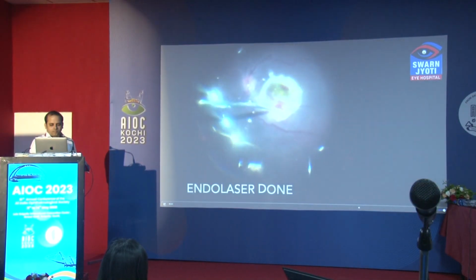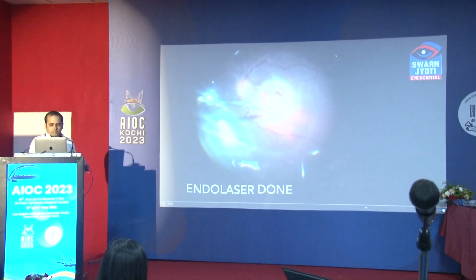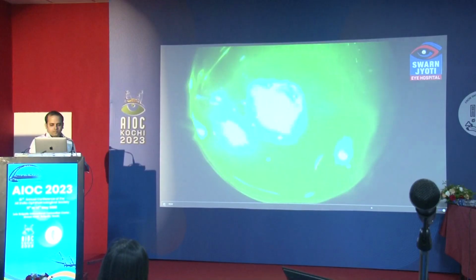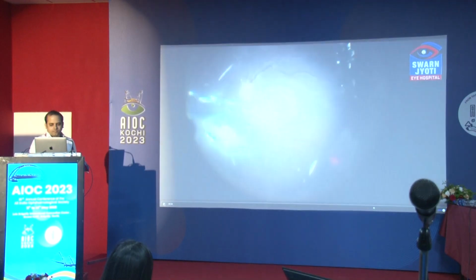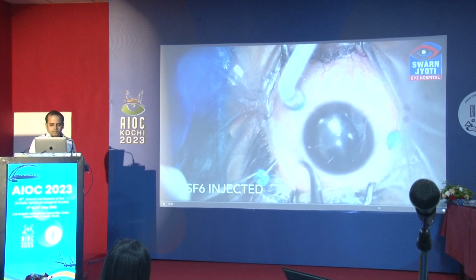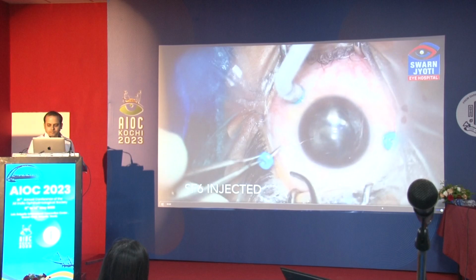The retinotomy site was then lasered with very light burns in a single row. SF6 gas was then injected, and after that the patient was advised to maintain prone position for another 1 week.